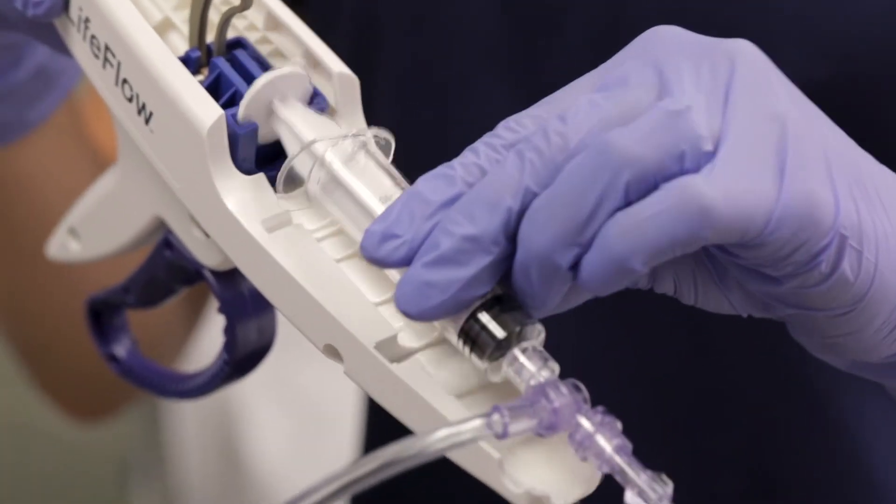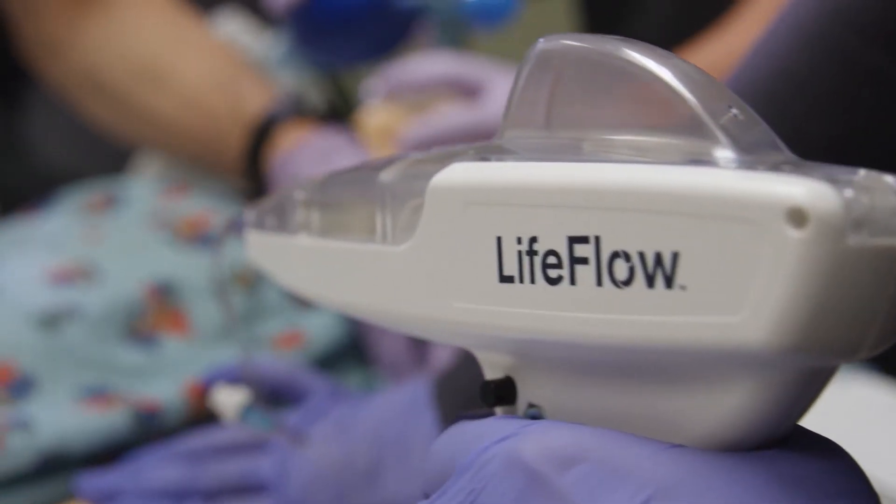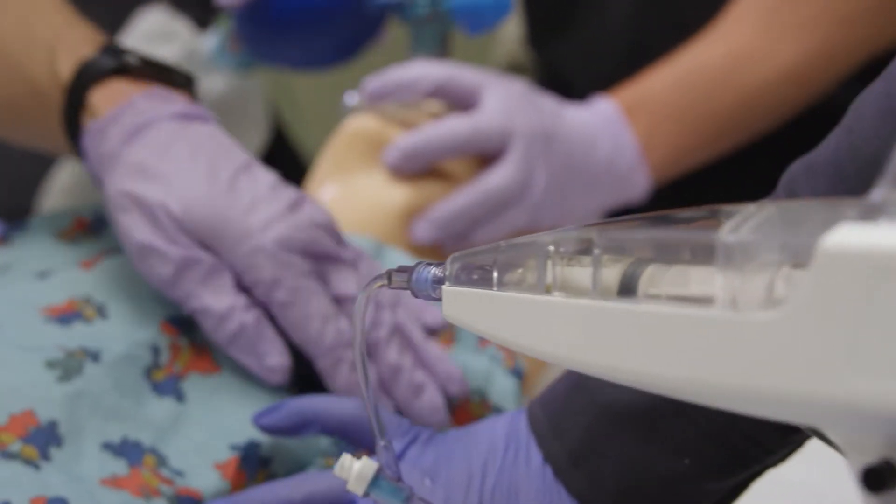With the Life Flow, you have 10 mLs every pull, and that is fast, and it's accurate, and it's easy to count.